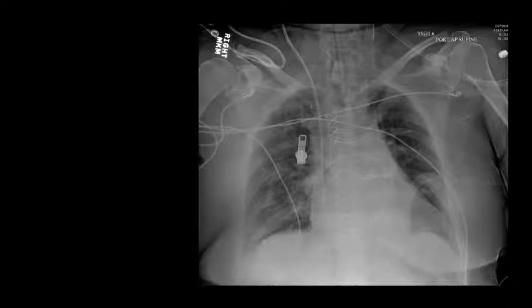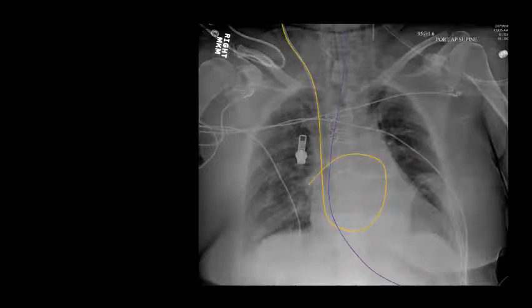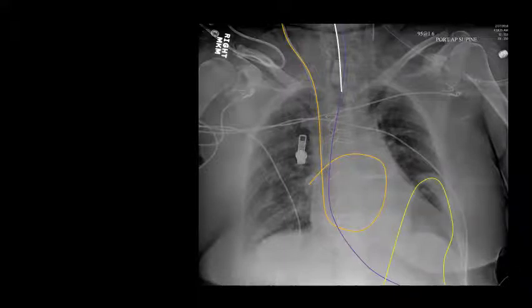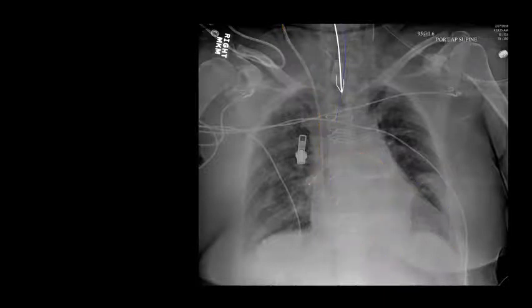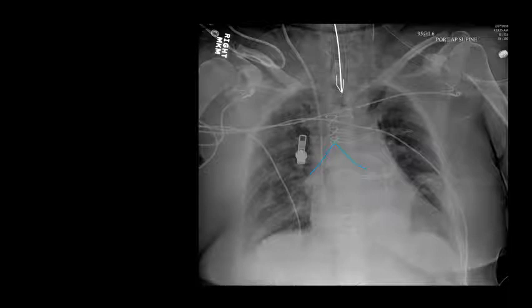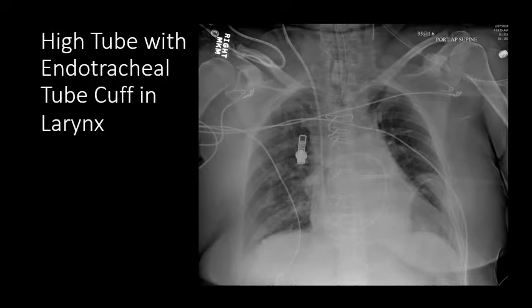Now take a look at this example and decide if you think the tube positioning is appropriate. This is a challenging case because there are multiple overlapping lines and tubes, but when we identify the thick white line that demarcates the endotracheal tube, we see the catheter terminating near the thoracic inlet. This is quite a distance from the carina and likely places the endotracheal cuff in the region of the true vocal folds. This catheter needs to be repositioned — it is too high.